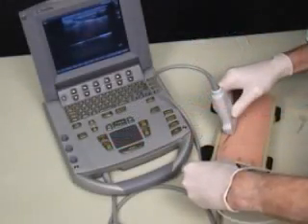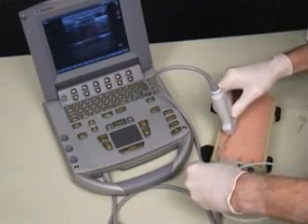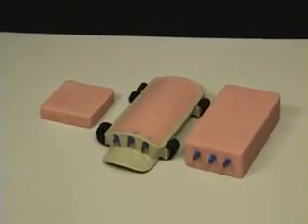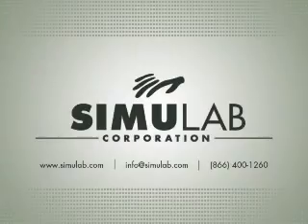Simulab's venipuncture pads are a cost effective and convenient solution for improving venipuncture skills and techniques. Thank you for your interest in the venipuncture pads. Contact Simulab today for more information.